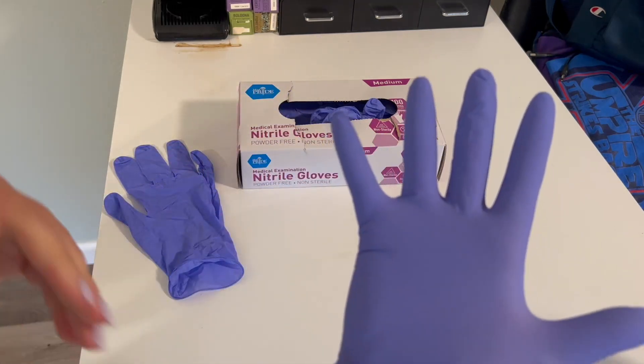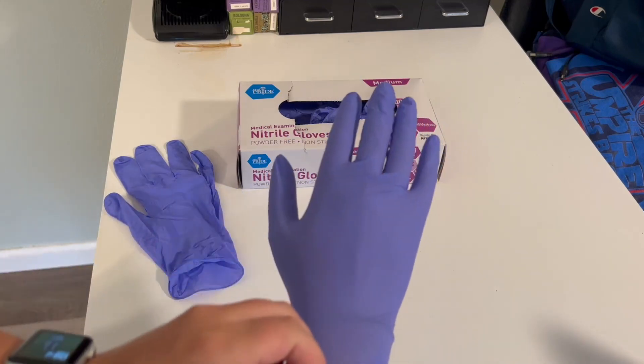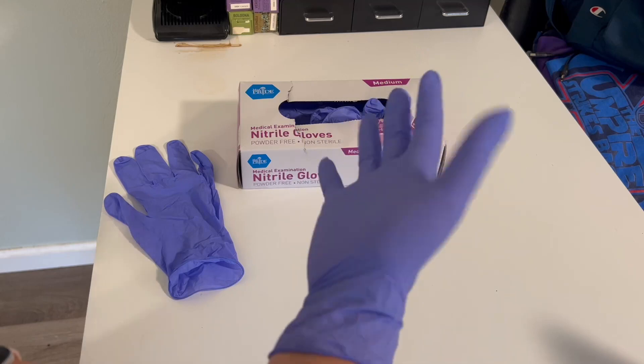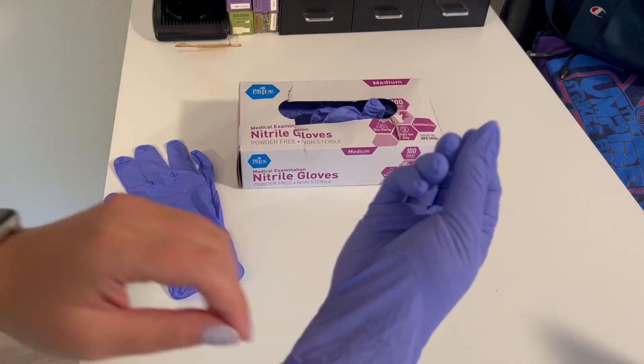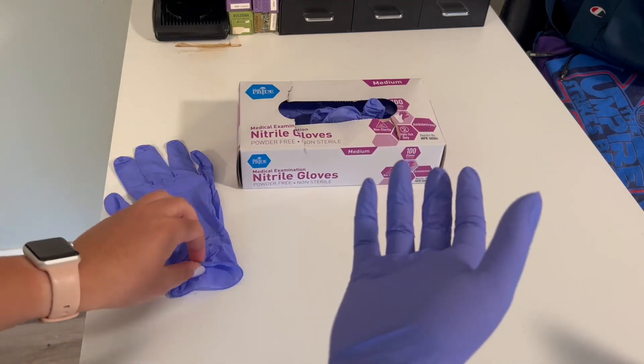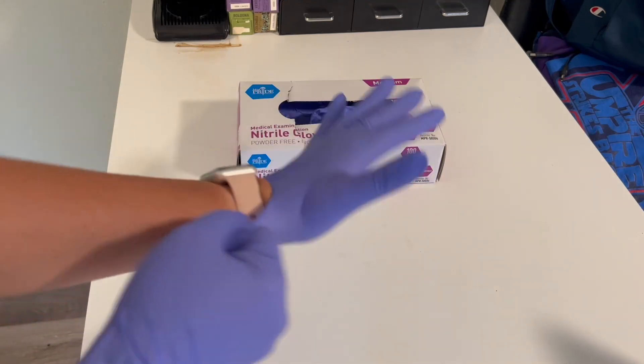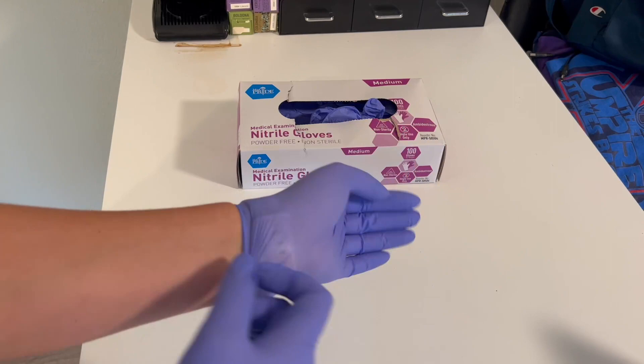I'll try them on for you. Just for reference, I'm a female, about 5'7 and 160 pounds, and these fit pretty much perfectly. There's some wiggle room in there, but they're tight enough that I can still use my fingers to pick up smaller things, and it's not going to get in the way because it's too baggy or anything like that.